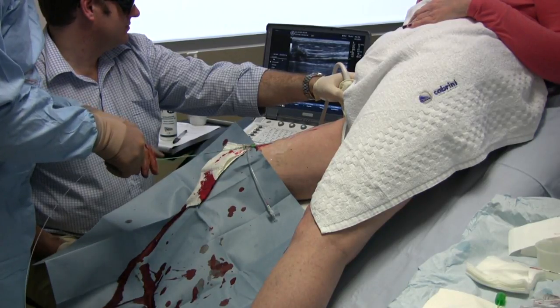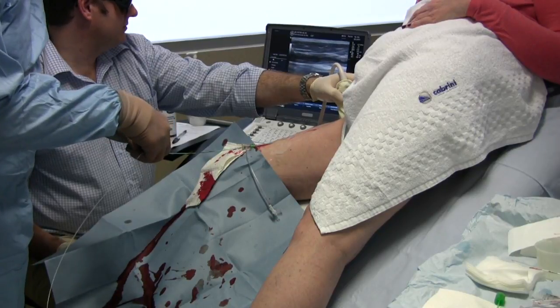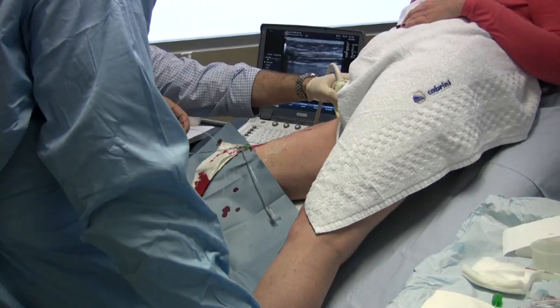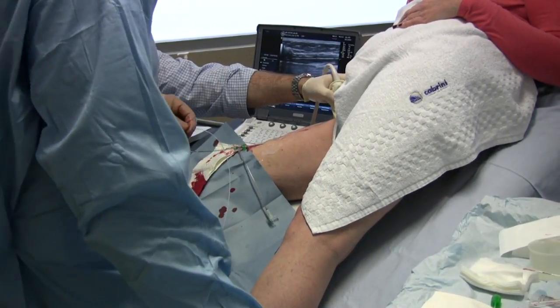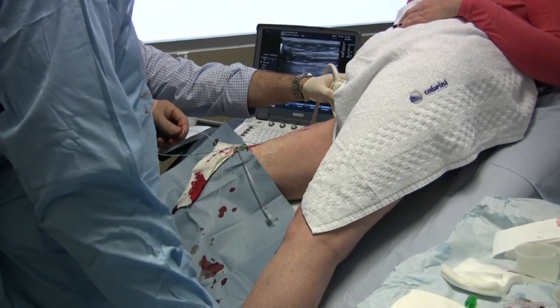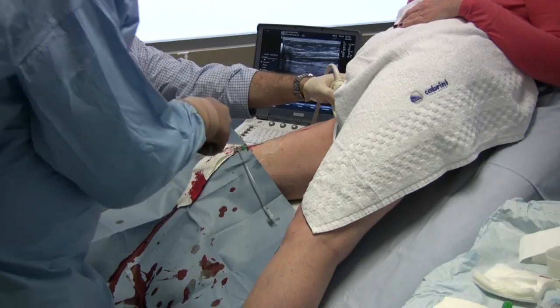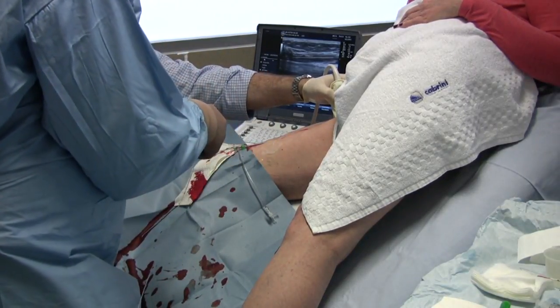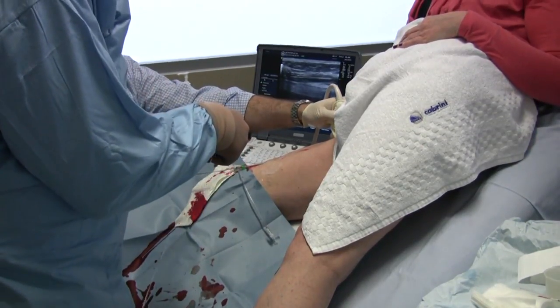by means of ultrasound. On the background image here you can see the tip of the laser fibre on the screen of the ultrasound. As the laser is activated, you can then see the actual vaporization of the vessel lining occurring in the form of bubbles occurring within the vessel lumen.